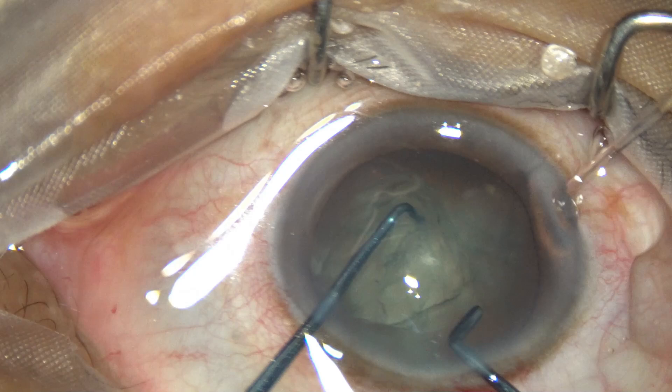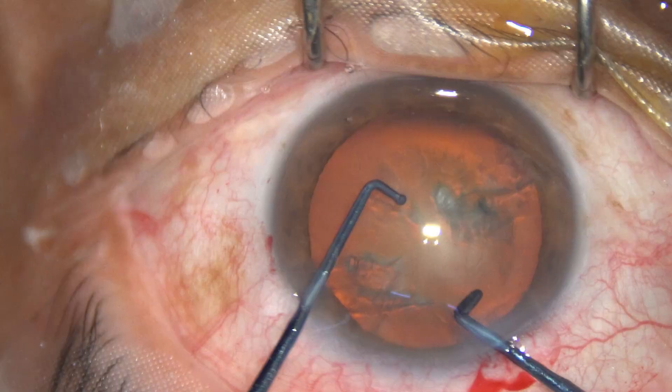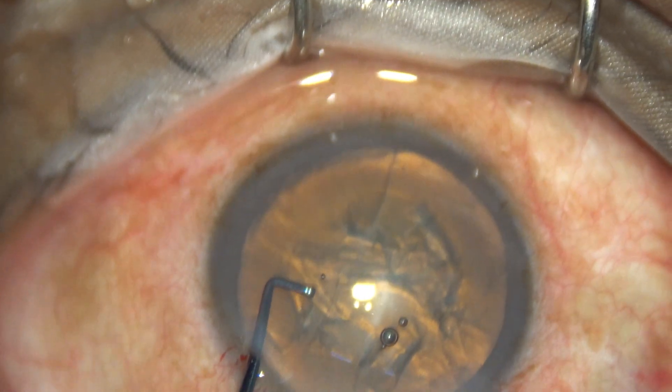Mohanta's Prechopper for cataract surgery. This instrument has been designed recently and this is the first video I am going to show. These are real-time video clips.